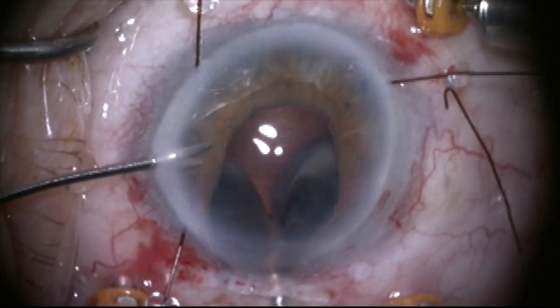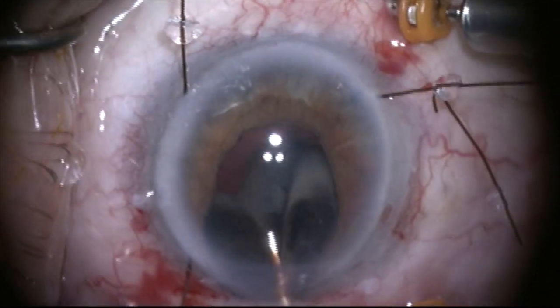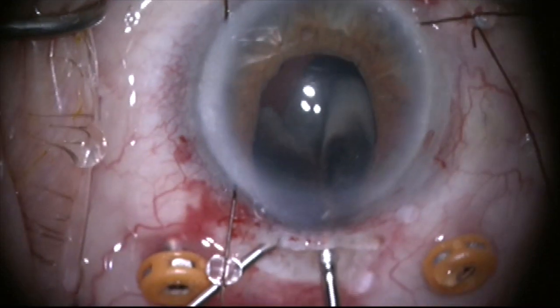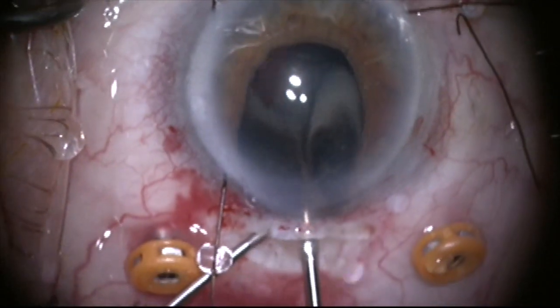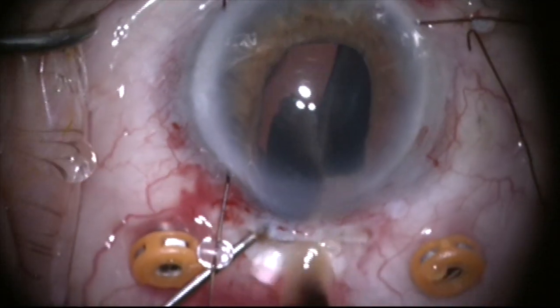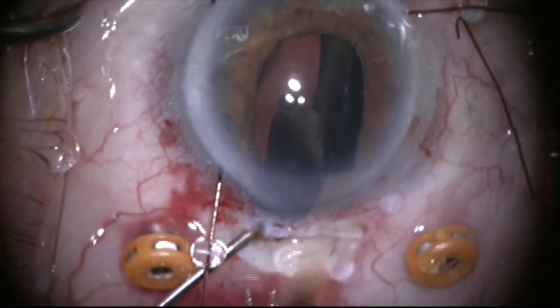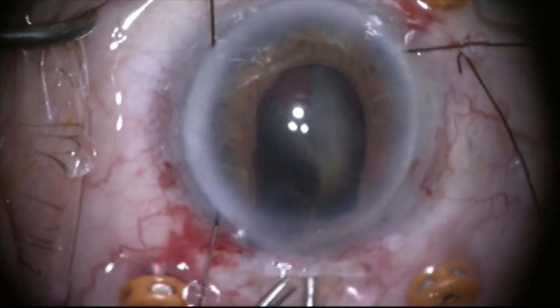Here you can see I'm going to try to use the infusion to push this Soemmering's ring material — which is very dense and dark, very unusual looking — out through this 6mm incision. But I'm only able to get some of this material out and the rest of it is going to fall into the back of the eye.